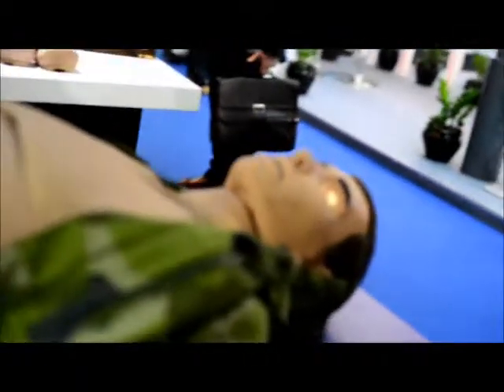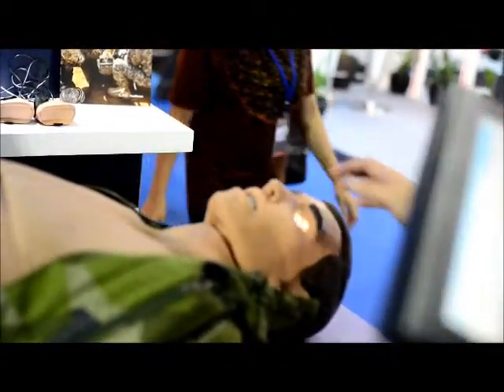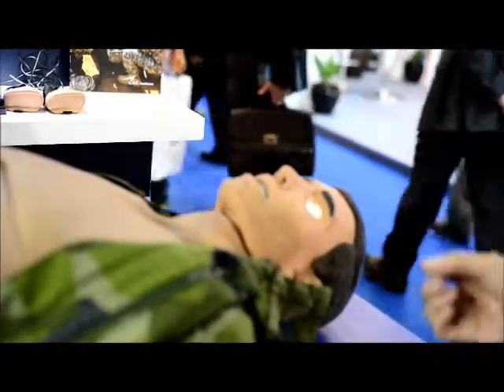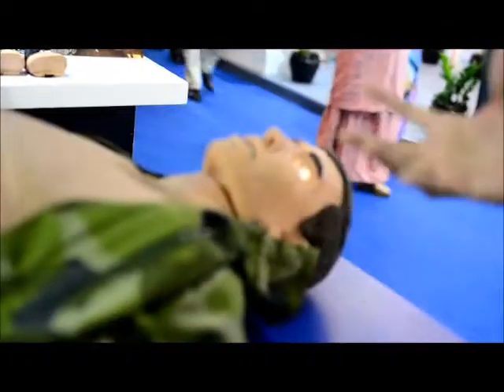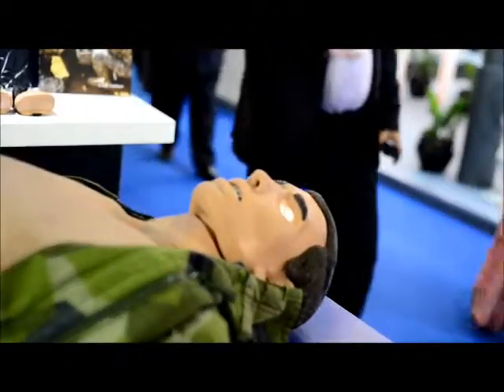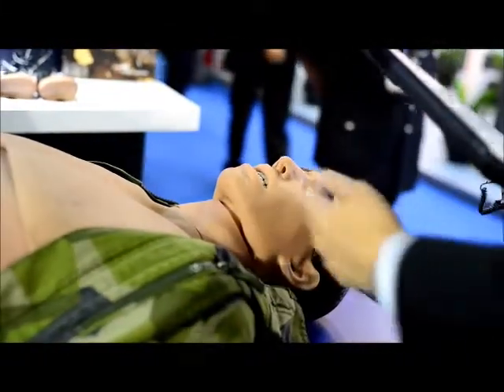CESAR has many other capabilities as well. We will be able to do pupil examination on CESAR because his pupils could constrict or be blown. He will be able to breathe on his own. You could do airway management, bag-mask intubation just like a medical doctor would do. And if there is a difficult airway situation you could actually physically do a surgical cricothyrotomy.